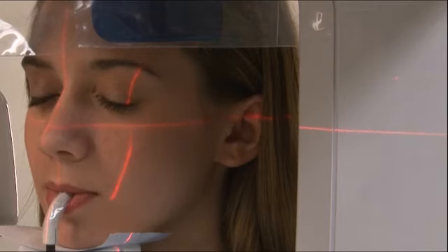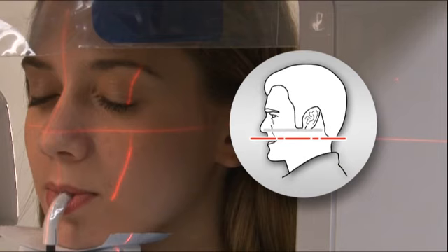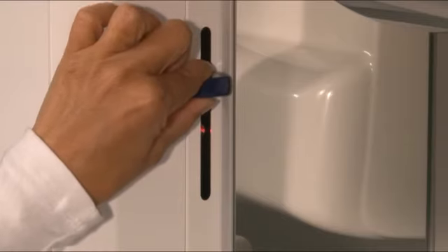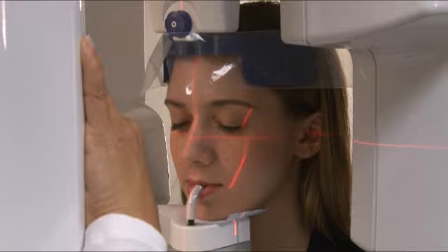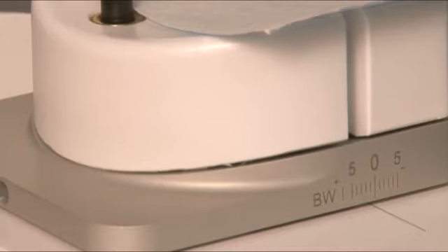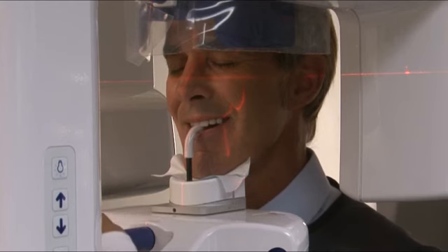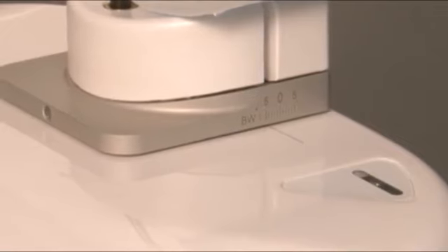For bite-wing projection horizontal placement, use the up and down buttons to bring the patient's occlusal plane parallel to the laser. If desired, laser lights can be raised or lowered before making adjustments to the Frankfurt or occlusal planes. For standard panoramic placement, adjust the chin rest either posteriorly or anteriorly so that the cuspids coincide with the laser. For bite wing projection placement, adjust the chin rest to the bite wing marker.